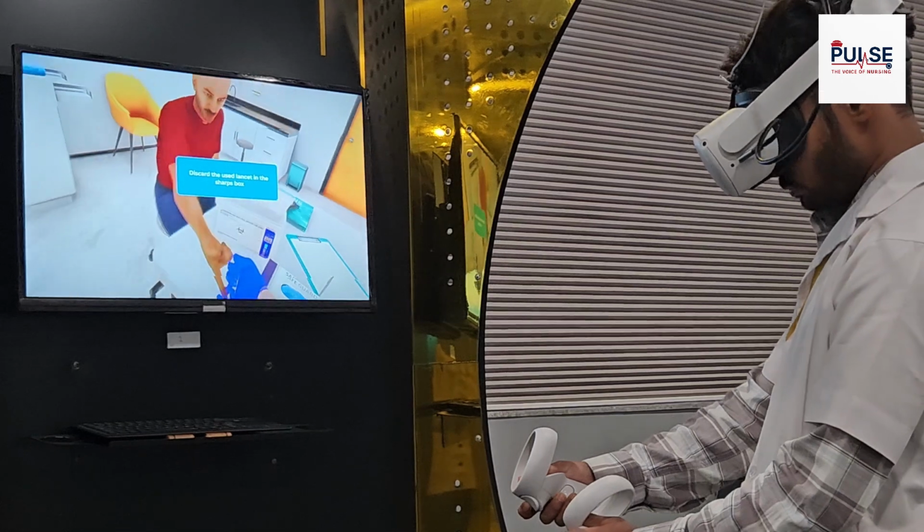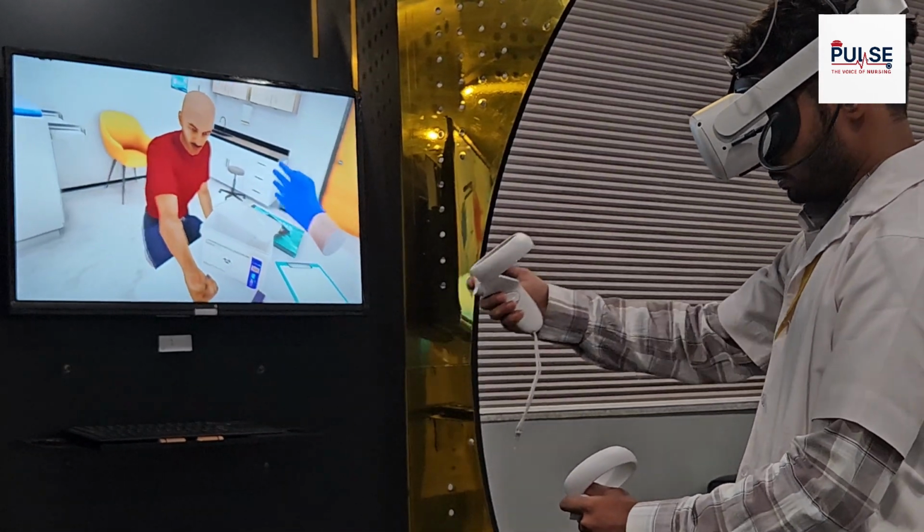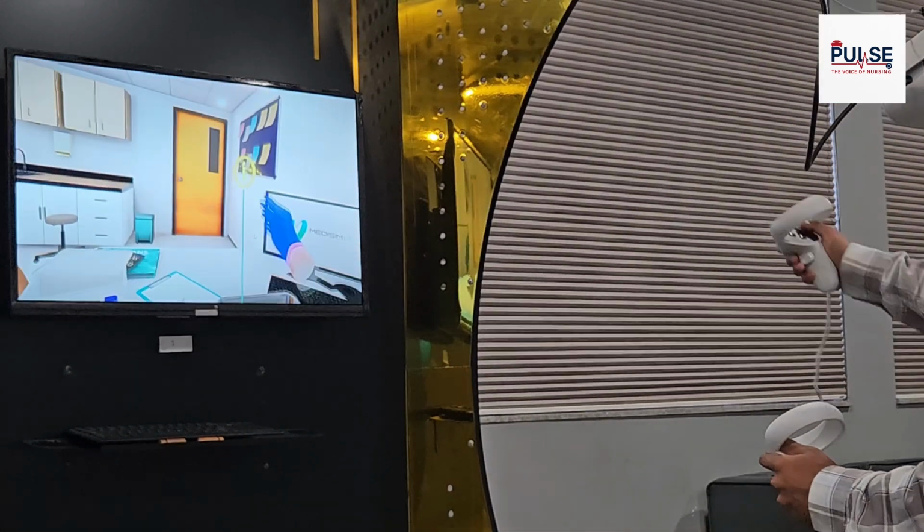Discard the used lancet in the sharps box. Now we are going to learn about the cotton ball. Tap on the N button.